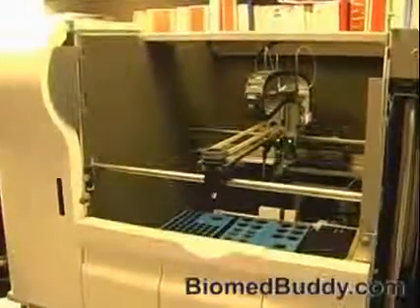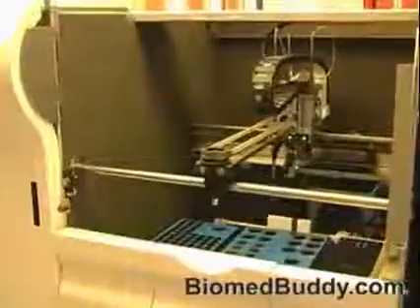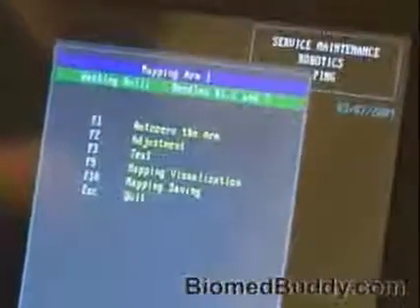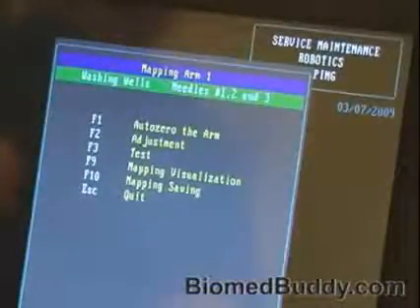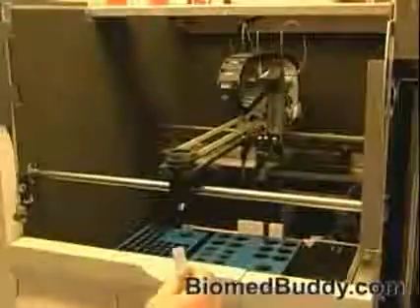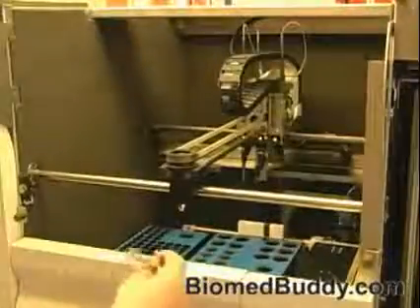We're talking about arm number 1, washing wells, first thing, and we're going to have to move back and forth a lot here, so I'm sorry. Arm number 1. Okay, now let's go into adjustment. F2 for adjustment. Alright, arm number 2 just went, arm number 1 just went over the wash wells.